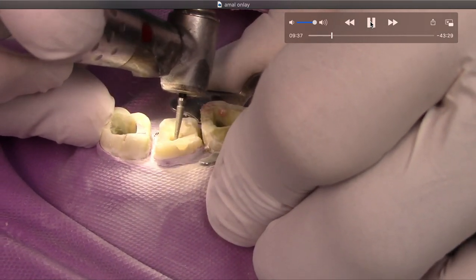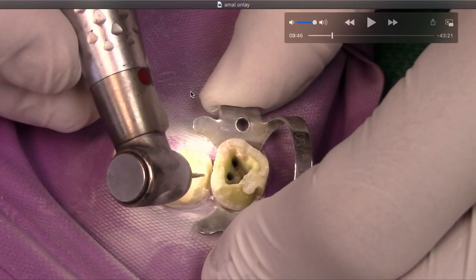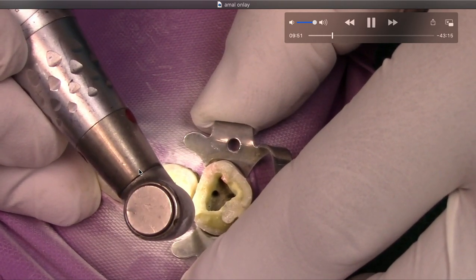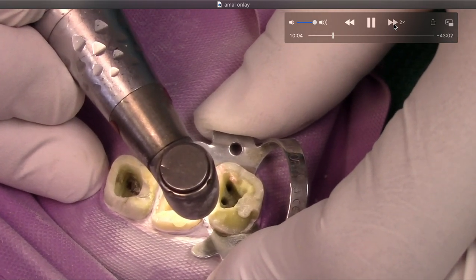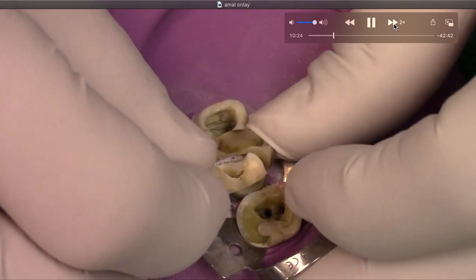We're going to round everything off. With an electric handpiece, one way to remember which handpiece is which: the red dot means danger — that's the high speed. Red is danger, so that's automatically the high speed when you pull it off. Blue is slow speed, and you can adjust the RPMs so you're not whittling away the tooth super fast. You can slow it down, round everything off, conserve tooth structure. It's great for refining crown margins — I'll spin it down to about 40,000 RPM to refine crown margins with a fine bur.